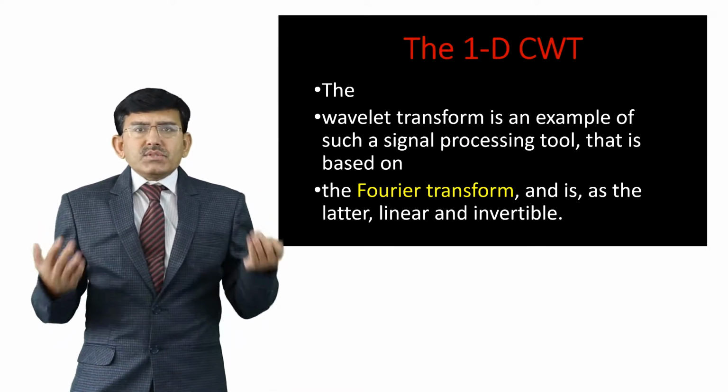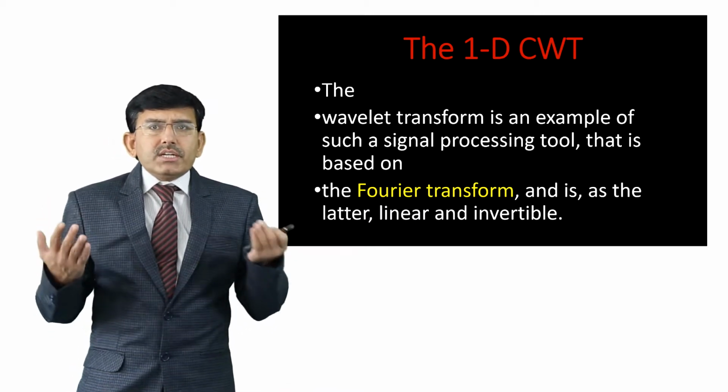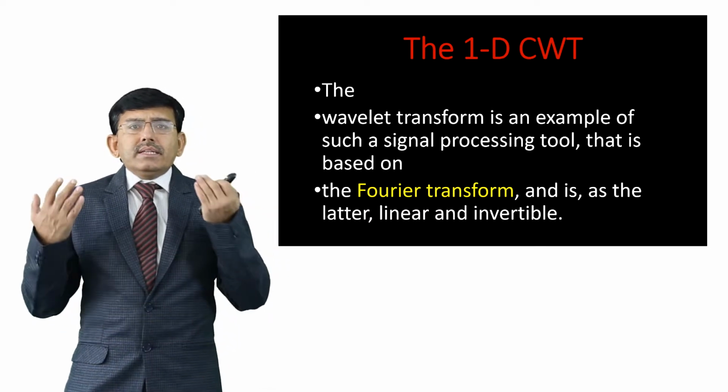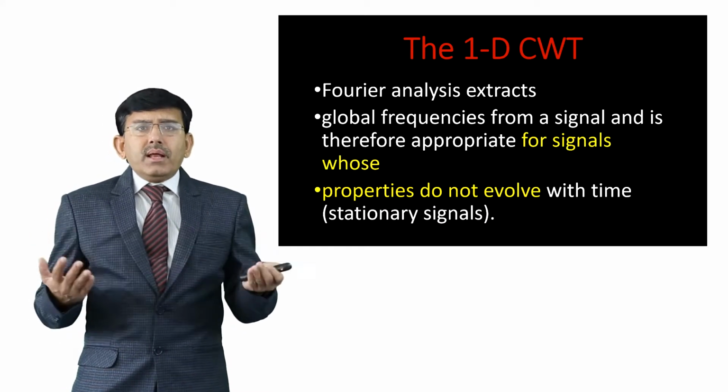The wavelet transform is an example of such a signal processing tool that is based on the Fourier transform, the latter being linear and invertible.